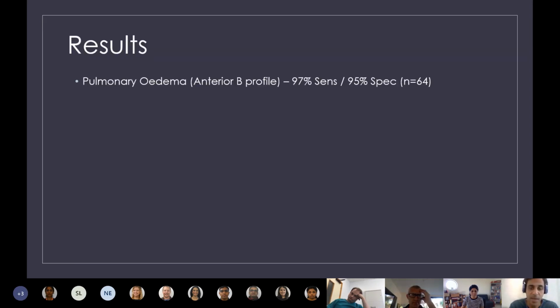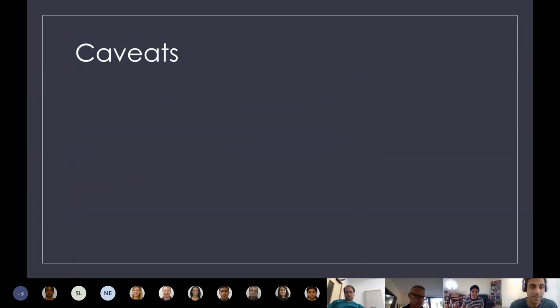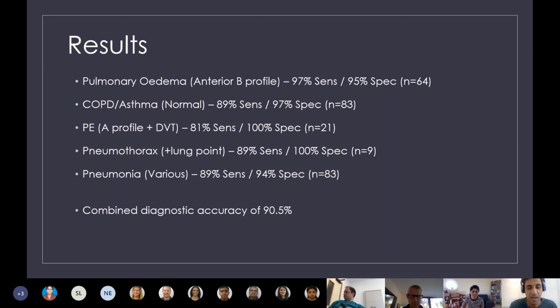And the numbers that they ran through this BLUE protocol to achieve that are shown here. Essentially, without going into too much detail, each one of them was very sensitive and specific for the diagnosis they came to once they compared them to the final diagnosis. And they come up with a combined diagnostic accuracy of 90.5%. So 90.5% of the patients that they saw and gave a diagnosis there and then within the first 20 minutes of their admission, within a 3-minute scan, at the end of their time in ICU, matched up. So that's what the strengths are really highlighted there of the BLUE protocol and the evidence that they were able to present.